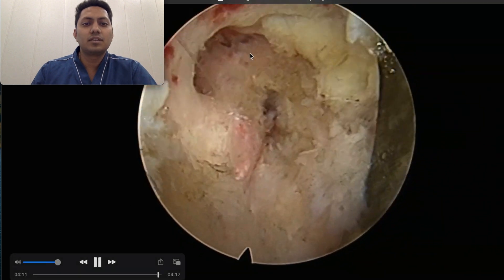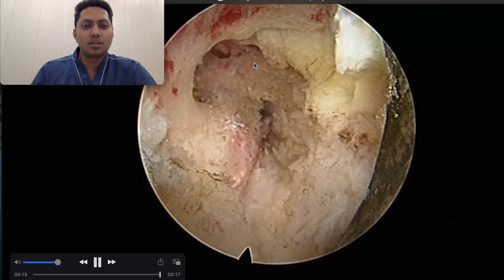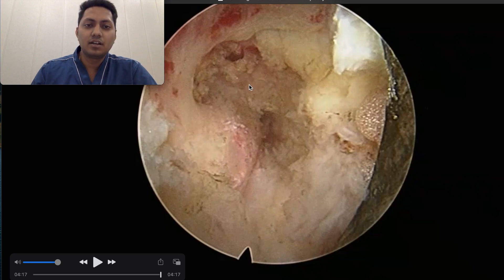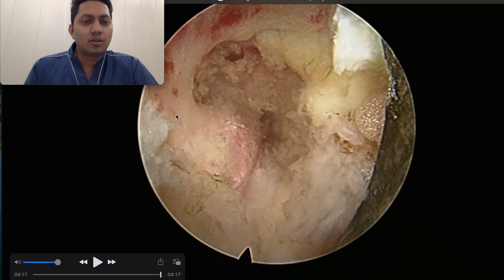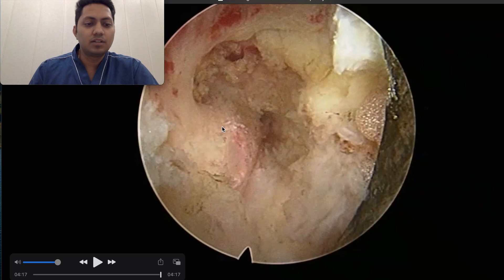You can see that we have adequately exposed this area. This is the down-migrated disc herniation which will be removed subsequently. This video is all about how we open up the foramen using an articulated burr. Before the procedure it was just looking like a slit, and now it is opened up so wide — we can very easily see the disc fragment. This was the original part of the pedicle, and the way we have cut this part of the pedicle is called the superior oblique pediculotomy, which can be very well achieved using an articulated burr.